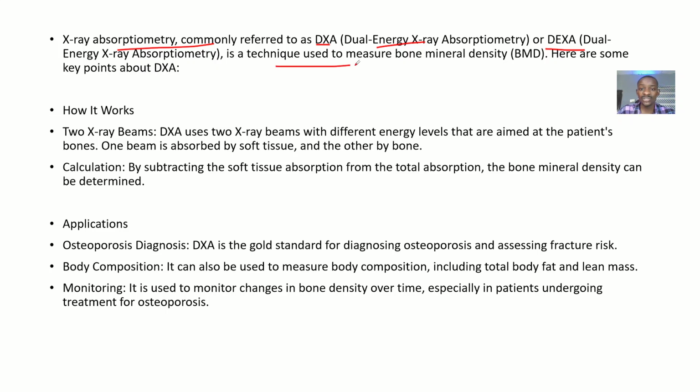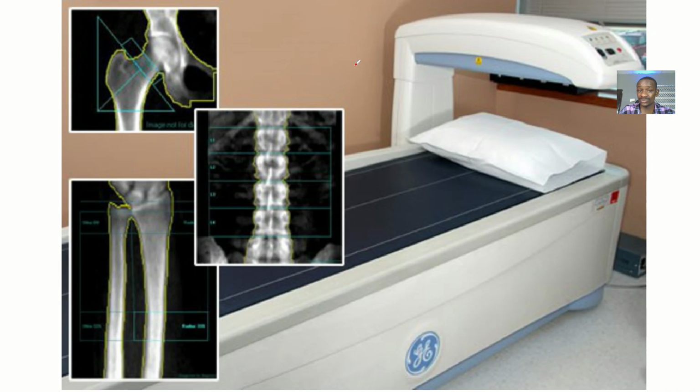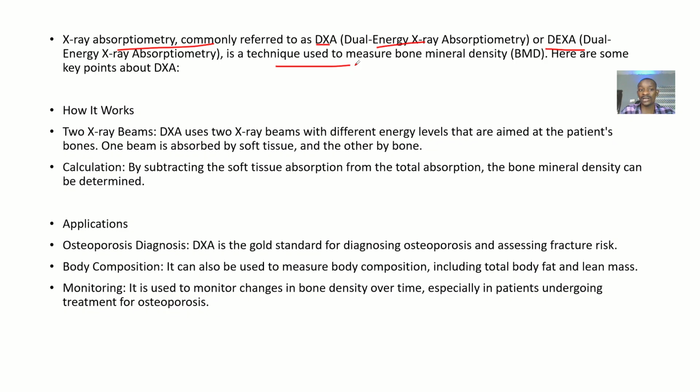It's a technique which is used to measure bone mineral density. You are doing it to measure the density of the bone, trying to see the amount of calcium that the bone has. So how does it work?